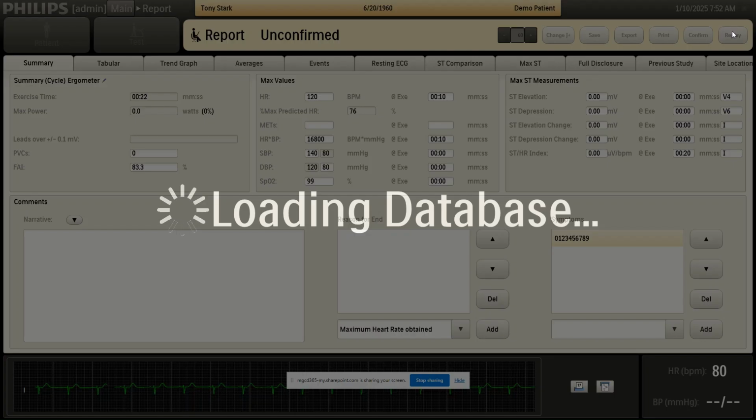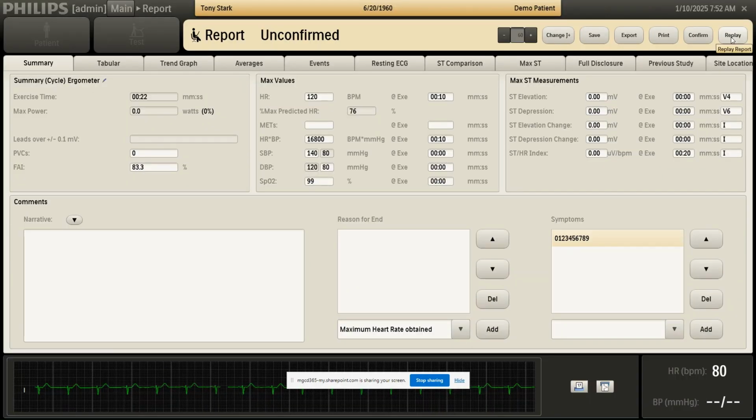They can also then do a replay of the study, which is a unique feature, similar to the old previous version of Mortara. I would encourage that you be outside of test mode with Breeze and or Ascent if that's open while you're utilizing the test replay.